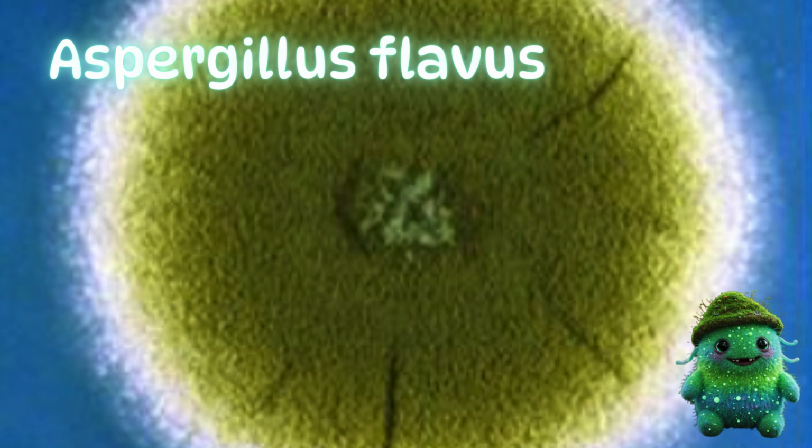Ranking in at number 3, we have Aspergillus flavus, which is known for its aflatoxins. It is the second most common cause of invasive aspergillosis. Its colony, when fully developed, is a beautiful yellow-green chartreuse or olive to gold color. The colony can become quite woolly in texture.